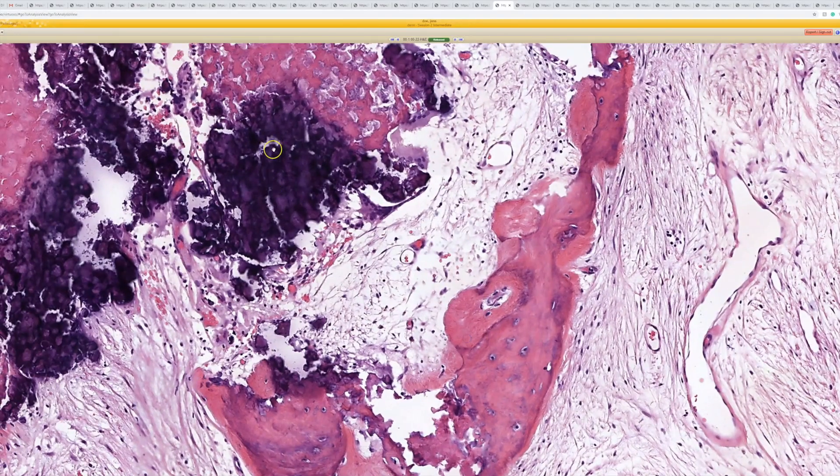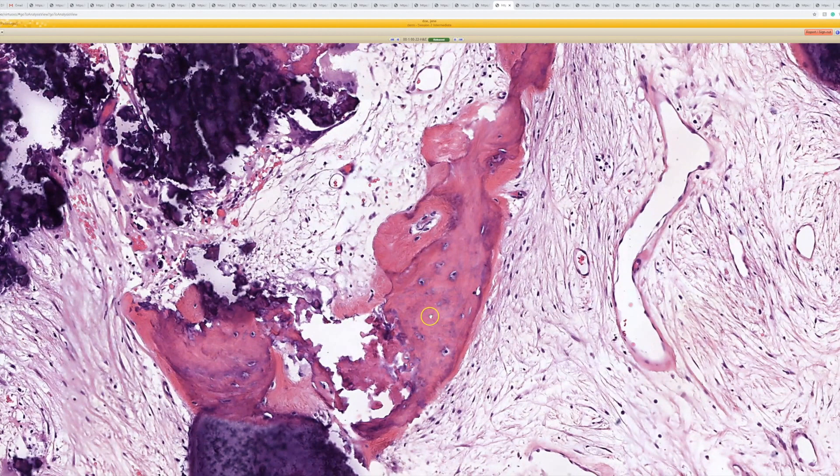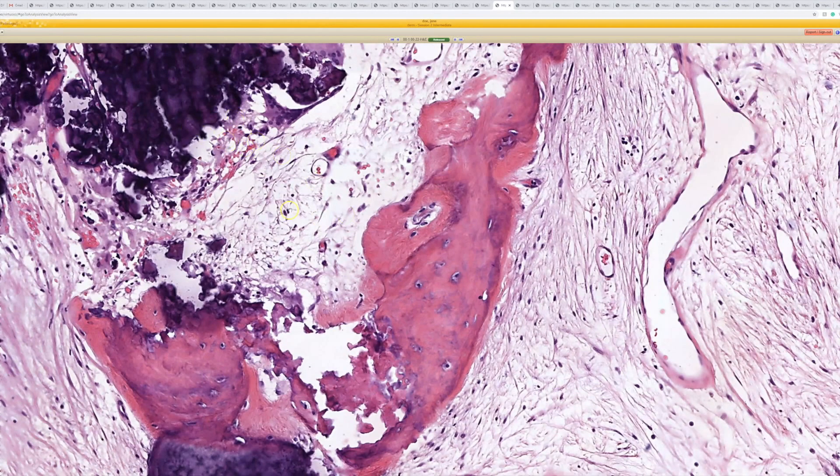How do you tell them apart? Well, calcium is kind of just fragmented and chunky purple stuff. Bone is actually going to be made not just of calcium, but calcium and collagen.